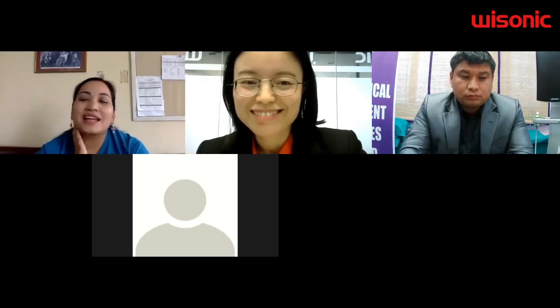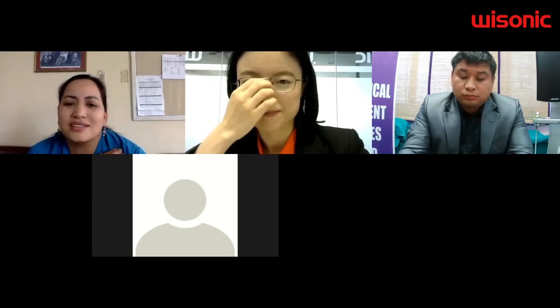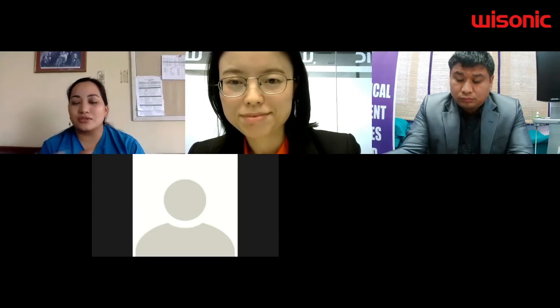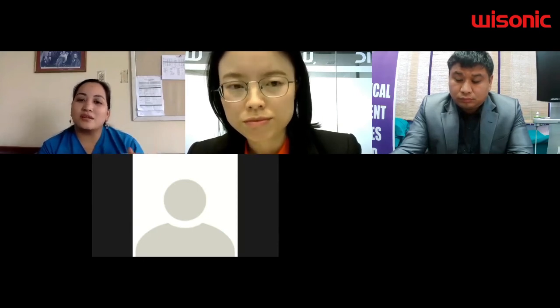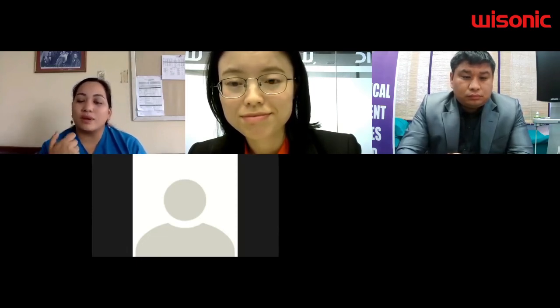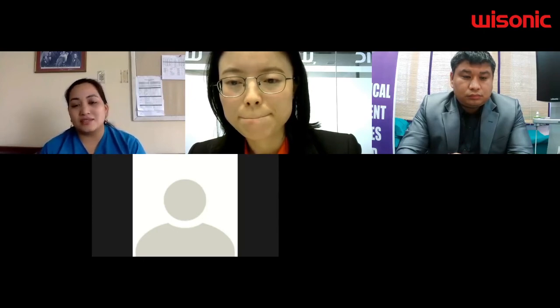Okay, thank you for that question. I talked about it in my presentation, actually. I know everybody tends to just palpate. It's a very superficial joint, so you tend to inject it. It's just below the skin, okay? But there are studies which have shown that when you inject by palpation method, as I've shown in my picture, just below the joint is the subacromial subdeltoid bursa or the supraspinatus muscle. So the depth of injection is actually difficult to judge if you're doing the palpation method. If you inject too deep, you may not be injecting inside the AC joint.